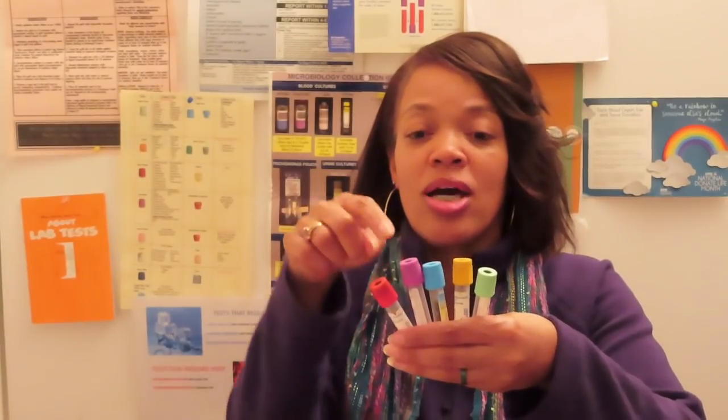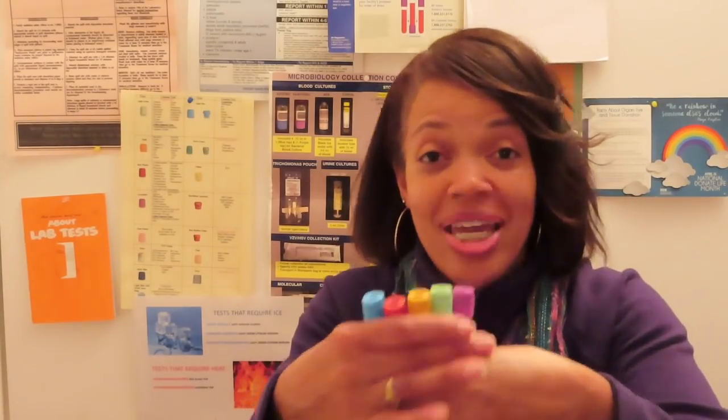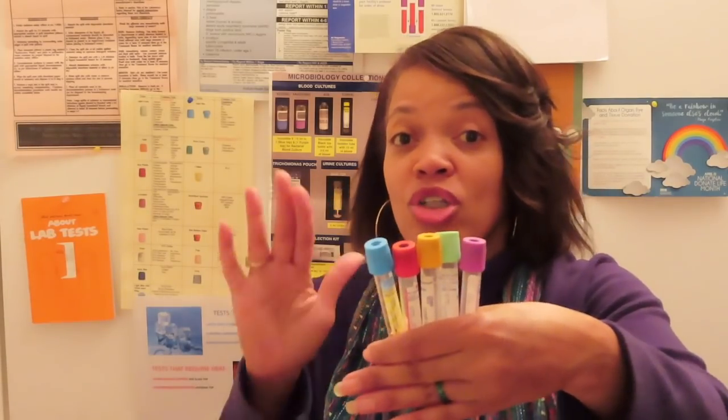These two are major because they need to stay in the order of draw to avoid cross-contamination. If you pull a lavender before the blue, that EDTA can get into that blue top. People don't believe it, but it happens — I've seen it and heard of it happening. So you have to follow your order of draw.